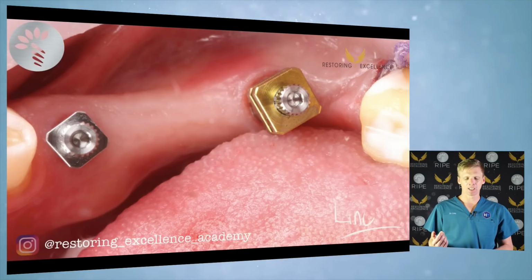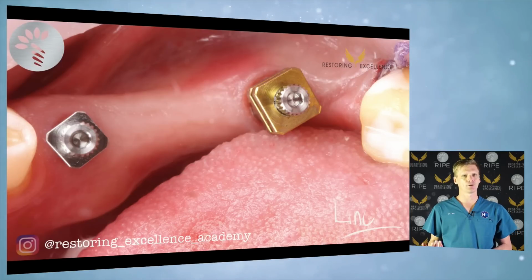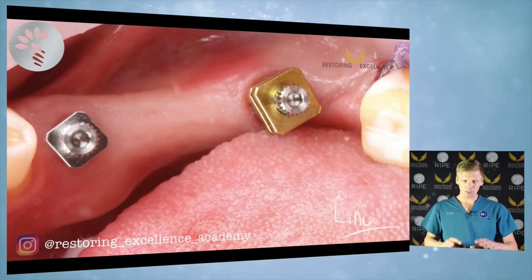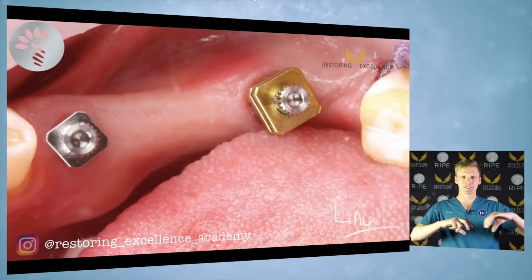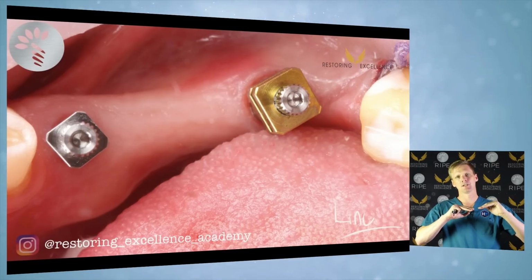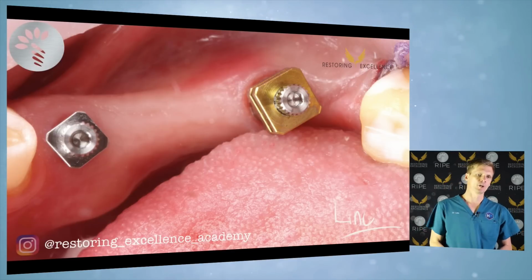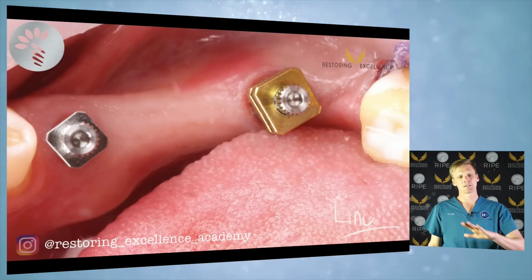I use a tray from Hagen and Werker, I think it is. I'll find a link and get it sent to you later. It is called a mirror tray. It is a stiff plastic tray, but it's got a clear foil on the back, so you don't have to drill holes in it. It's a stock tray, works with 99% of implant cases, and just push it in.